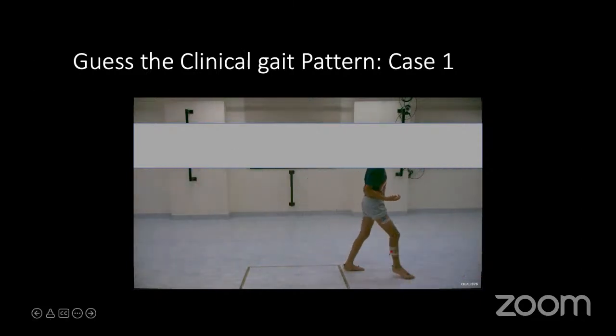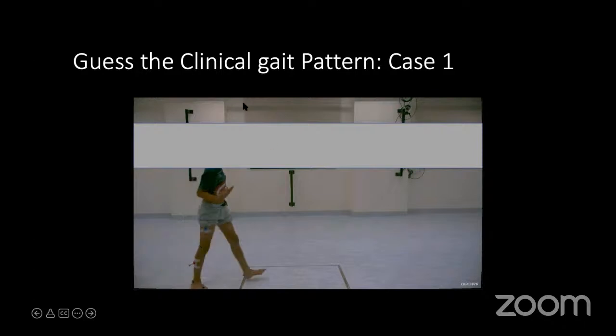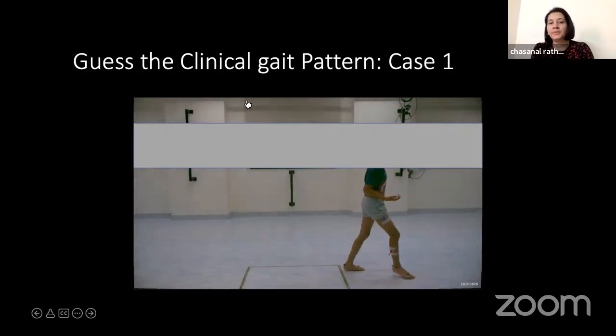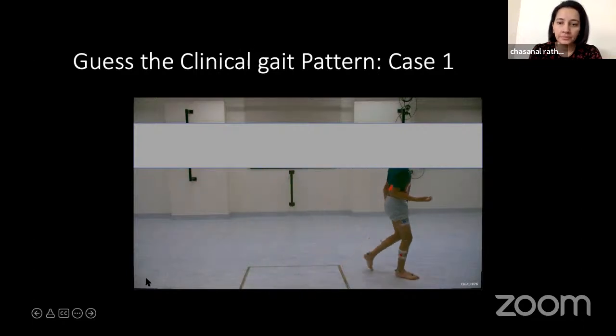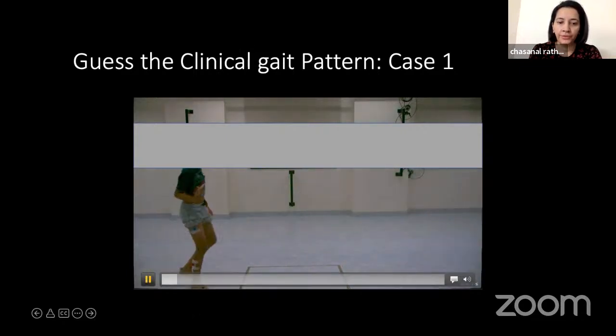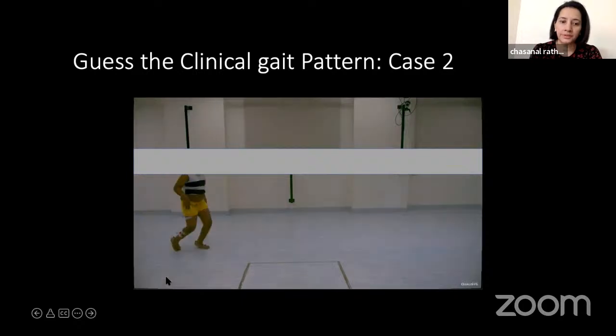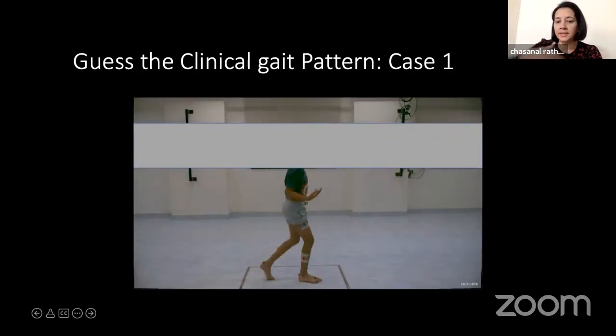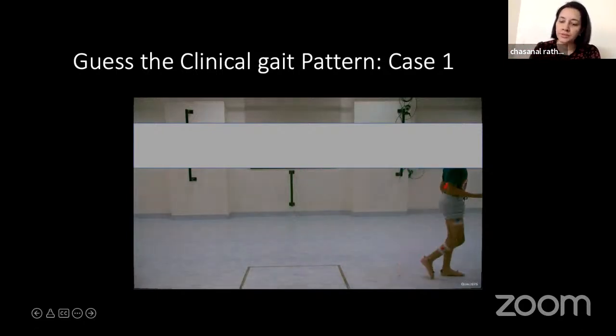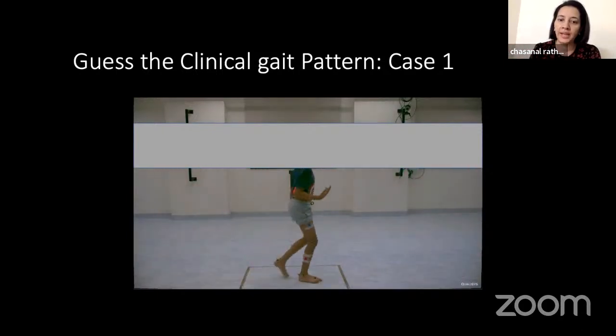It's a type 1 gait, ma'am, because it's type 1 hemiplegic. Yeah. So it's a type 1 hemiplegic. You see the child has difficulty in clearing the foot. If you have a look here. So it's a type 1 hemiplegic gait, and there is a sudden slapping of foot and he tries to clear the foot. So this is type 1 hemi.